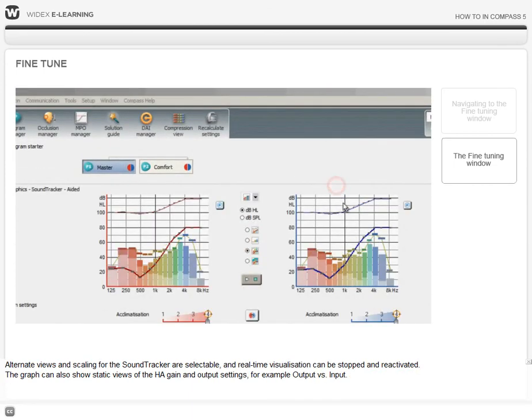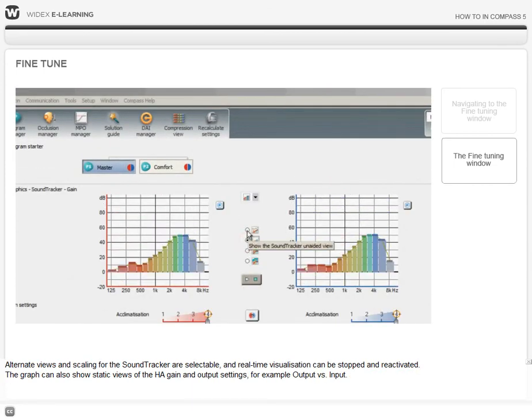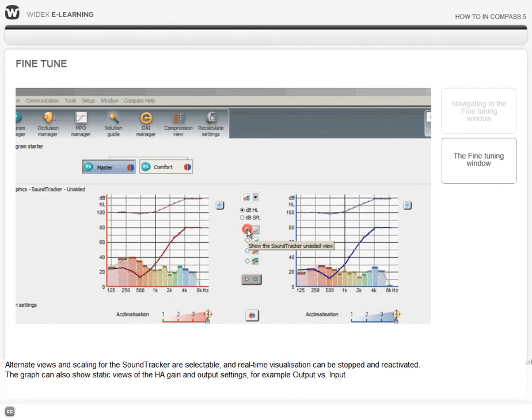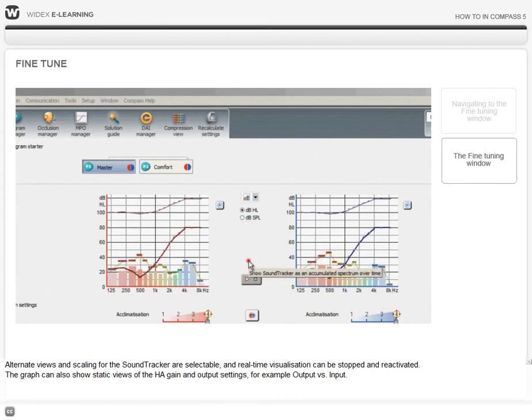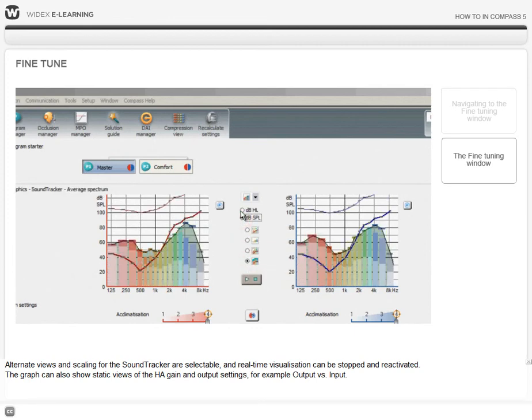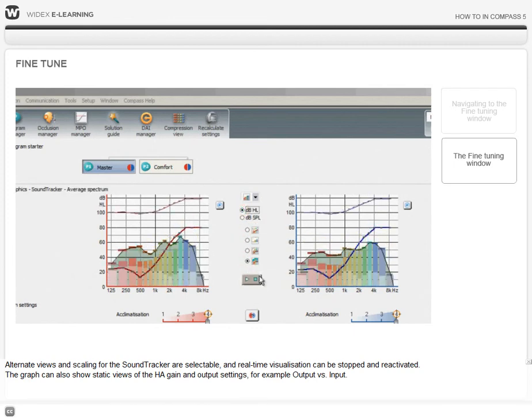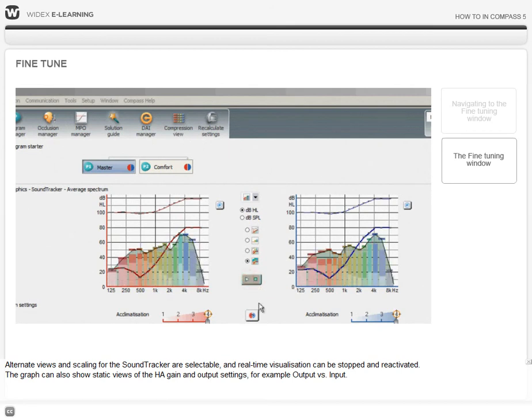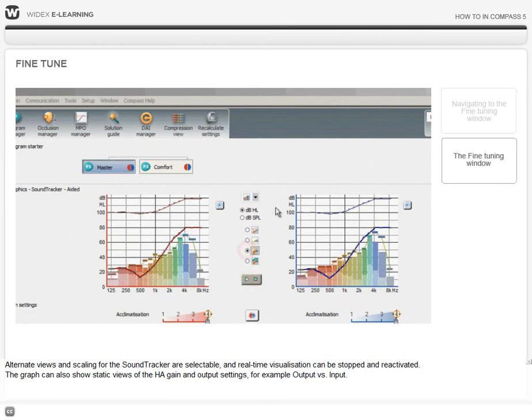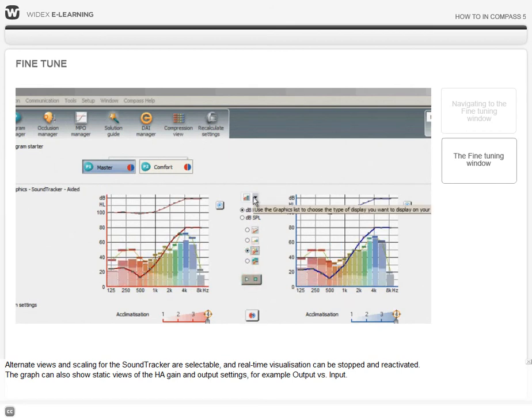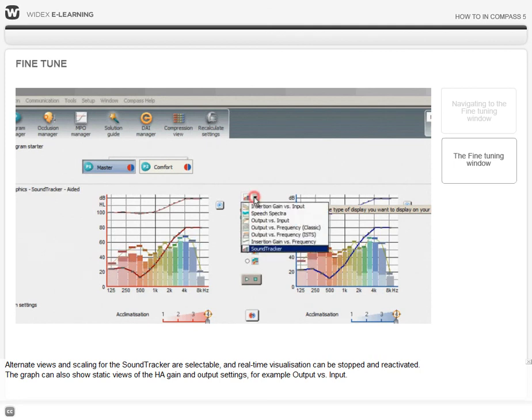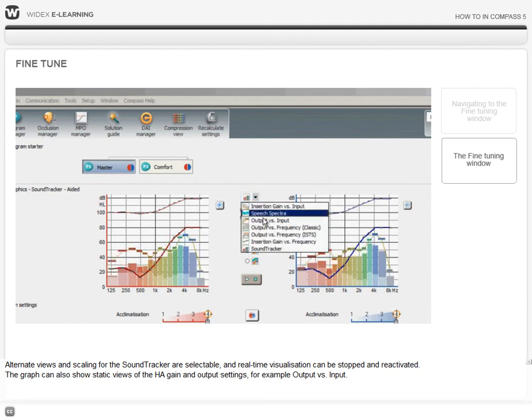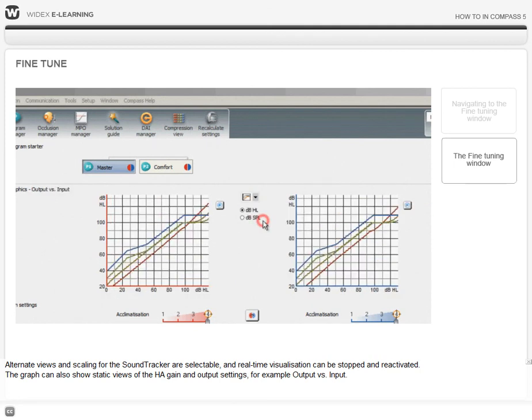Alternate views and scaling for the sound tracker are selectable, and real-time visualization can be stopped and reactivated. The graph can also show static views of the hearing aid gain and output settings, for example, output versus input.